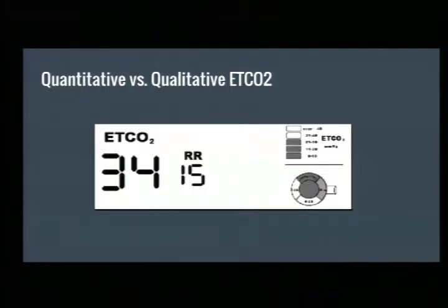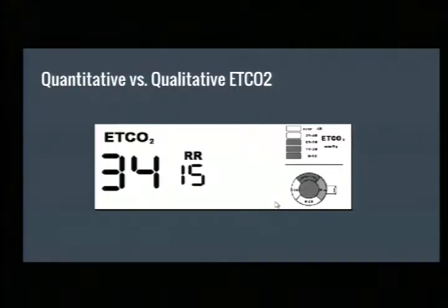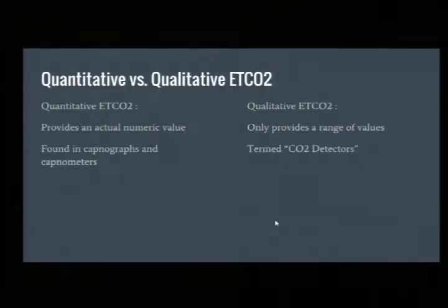An actual capnography. Interesting. Yeah, because we don't even stock those color change things anymore. And yeah, those little NICU ones are teeny tiny. But old school, we still have some of those probably laying around at different places, like peds.